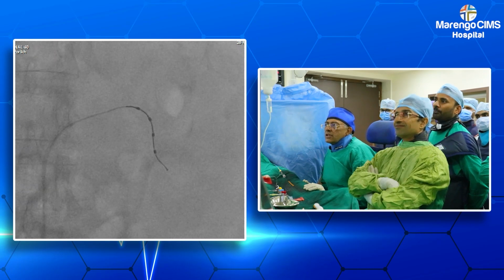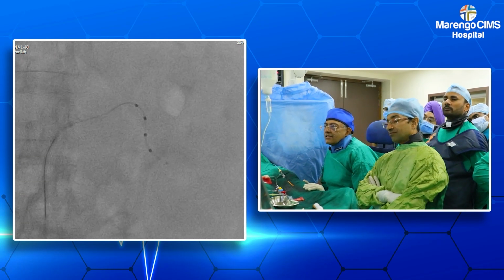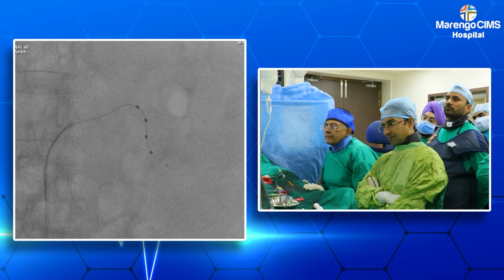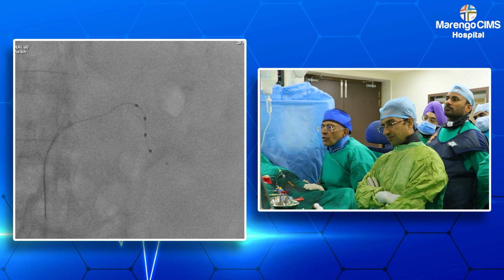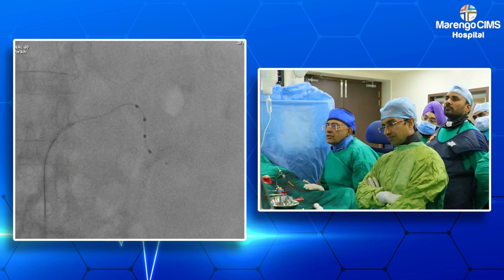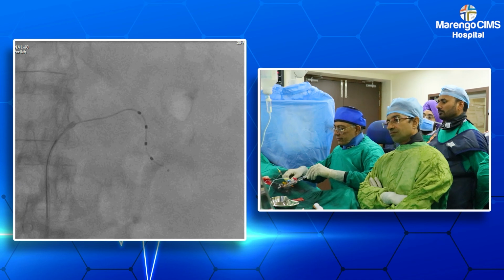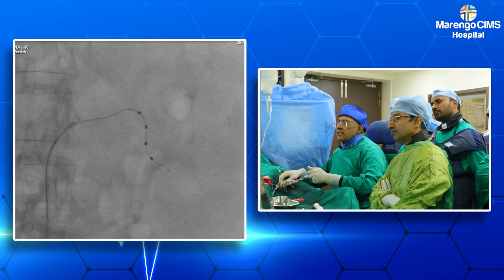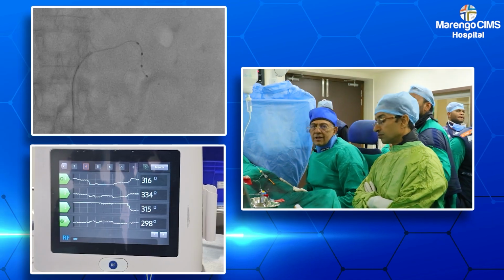So we have repositioned the catheter in the middle inferior renal branch adequately with 3 electrodes inside that branch and the 4th electrode in the main renal artery. All 4 electrodes are in adequate position and missing the carina. So we have decided to go ahead and ablate in all those 4 areas. We will recheck and looks okay.